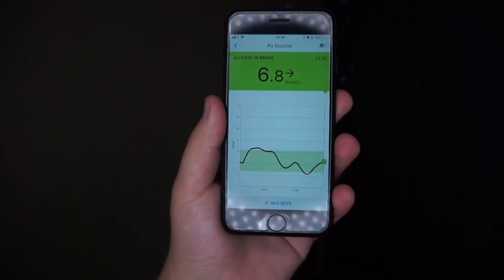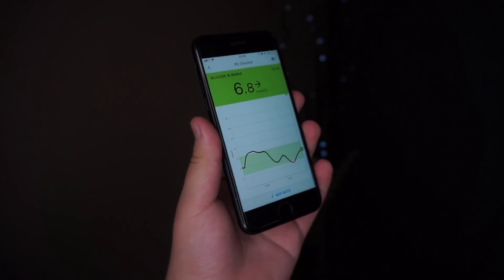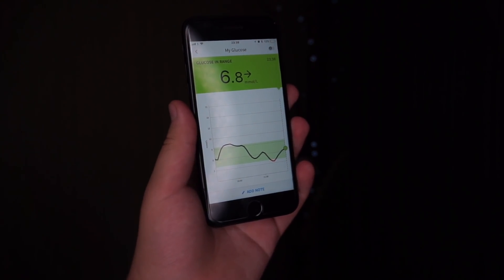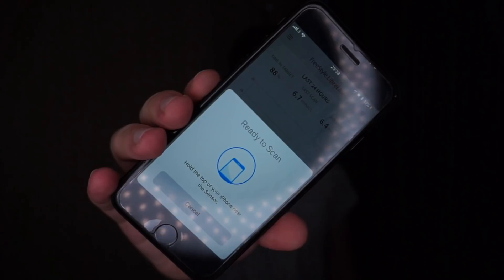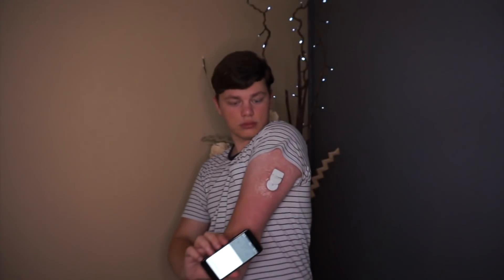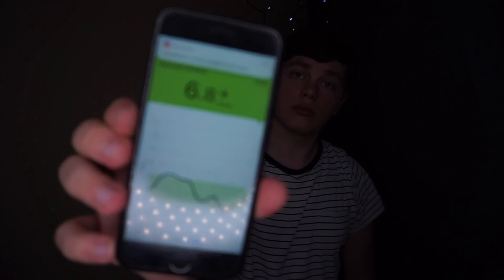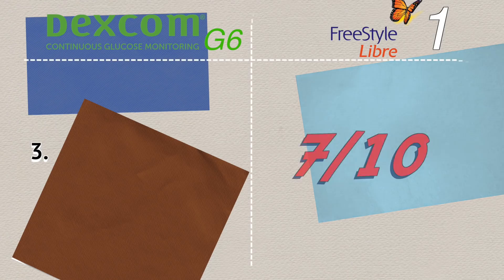In terms of the Libre app versus the Dexcom app: the LibreLink app is okay. It has everything you'd expect from a CGM app — reports, logbook, etc. There are things it should have, like Health app integration, but overall I recommend it and it has replaced my Libre reader. So the Libre app gets 7 out of 10.